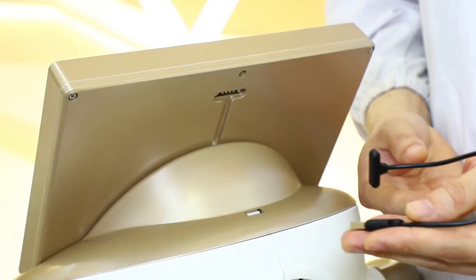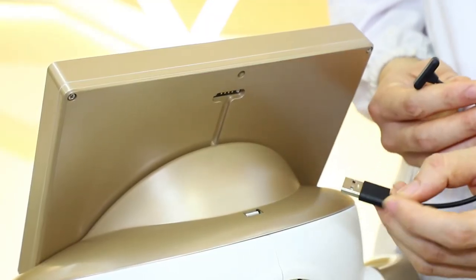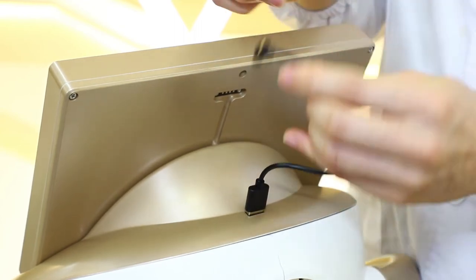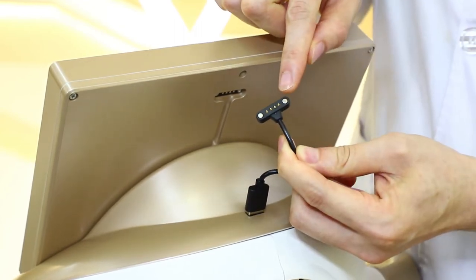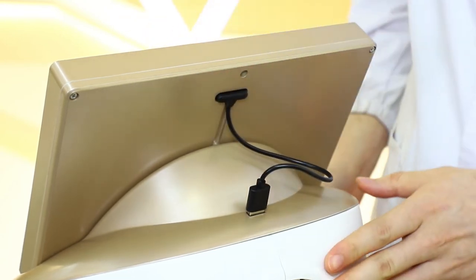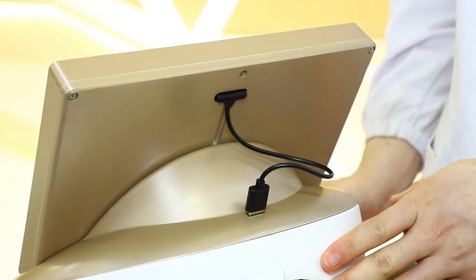So we fetch the connecting cable and connect this end to the machine. This is the magnetic connector, so we can stick it to the screen. The installation of the screen is now complete.